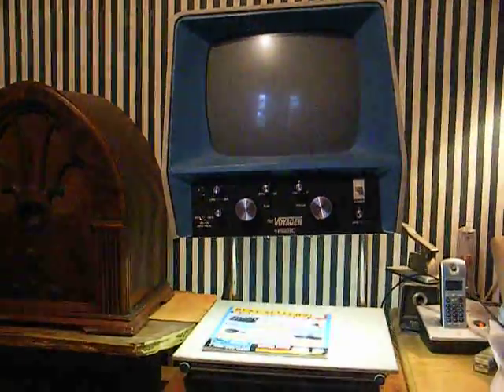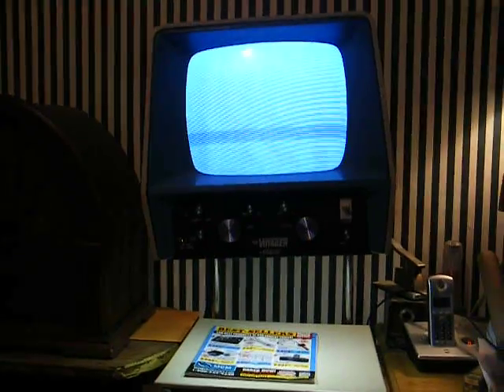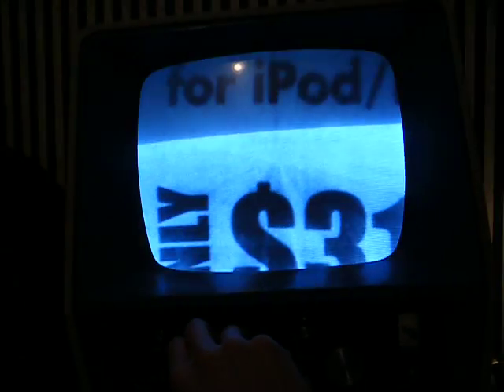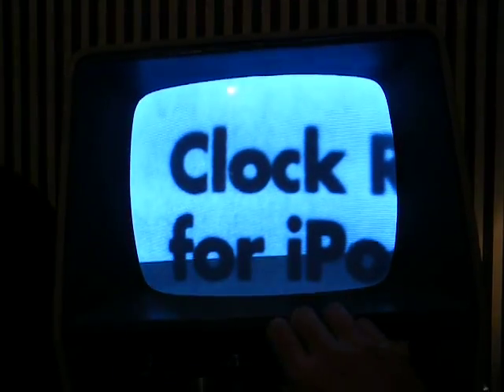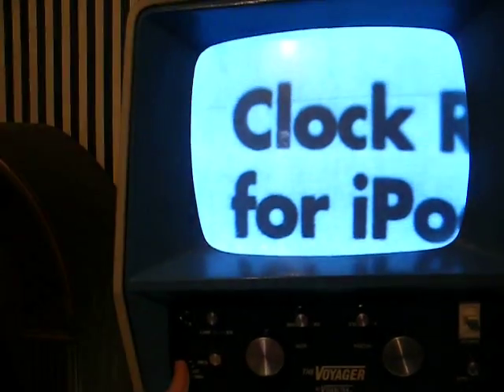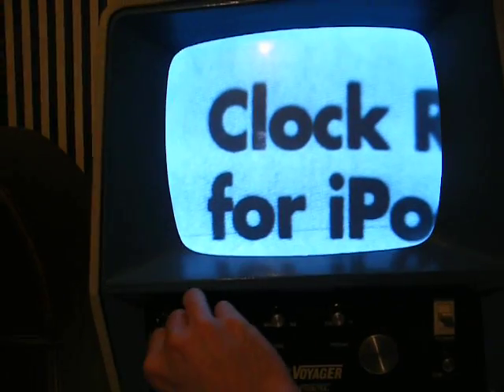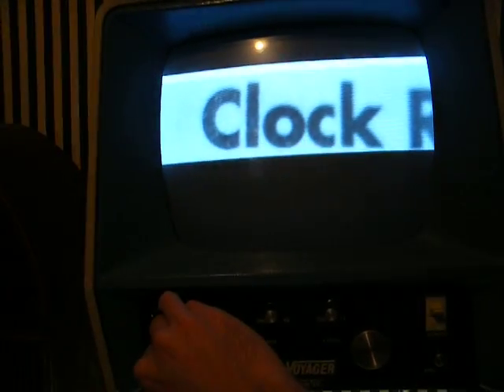Let me turn it on and give you a look, although it's not going to show up very well on the camera. Here's our size control — we can get it pretty much as big as we need it to be. Here's our focus control, and we also have contrast and brightness. There's a switch to reverse the polarity, and controls to highlight a certain portion of text.